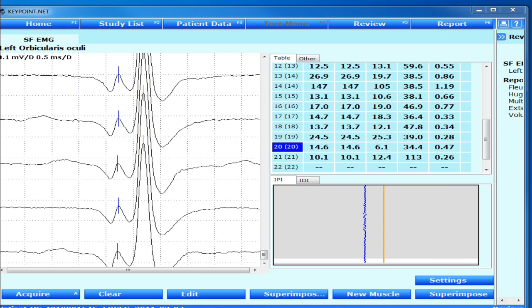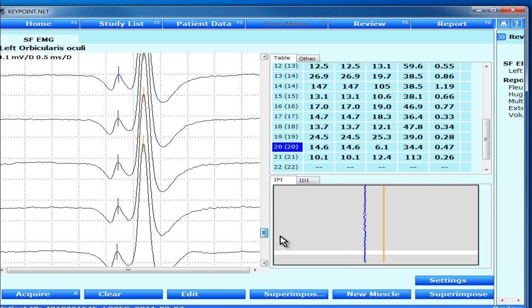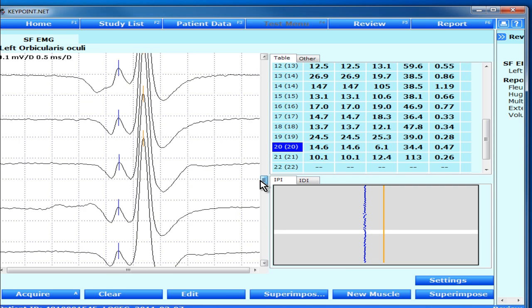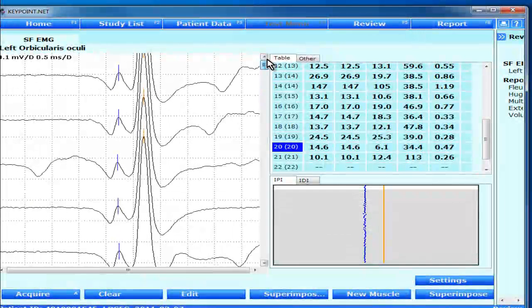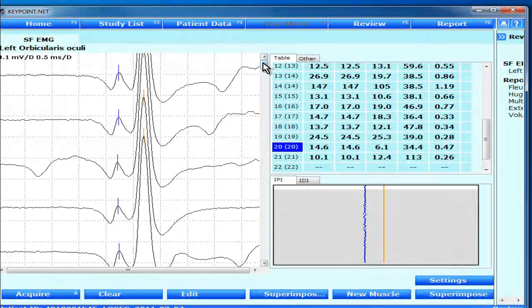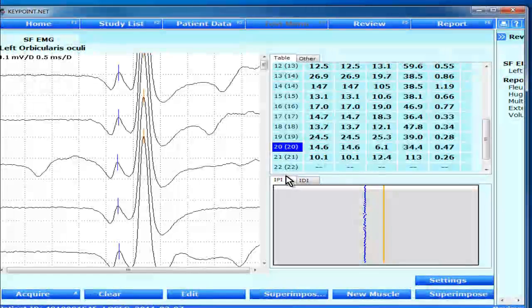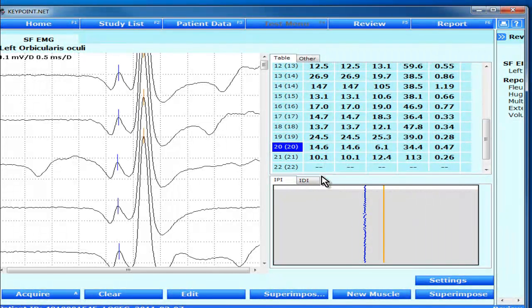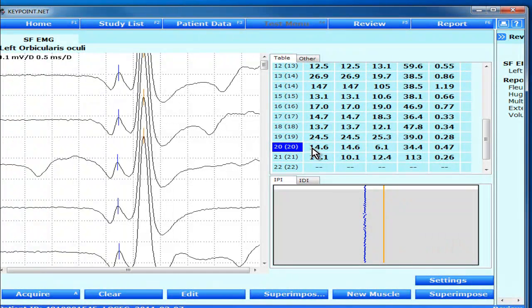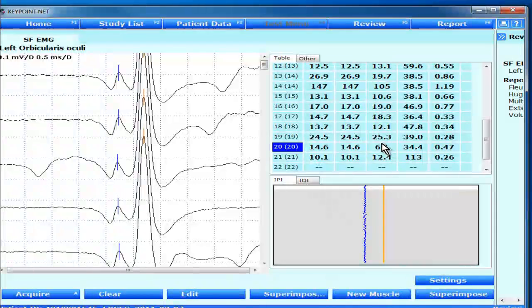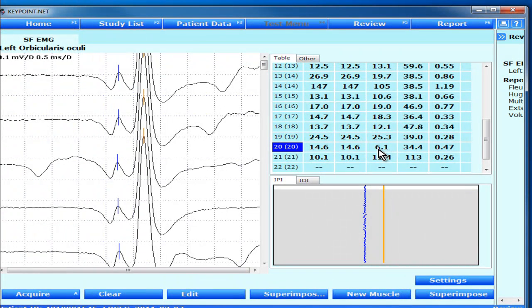Recording during voluntary contraction from orbicularis oculi, and the signals look quite nice—apparent single fiber potentials. The only comment I want to make here is that the MCD value is 14.6 while the MSD value is so much smaller.